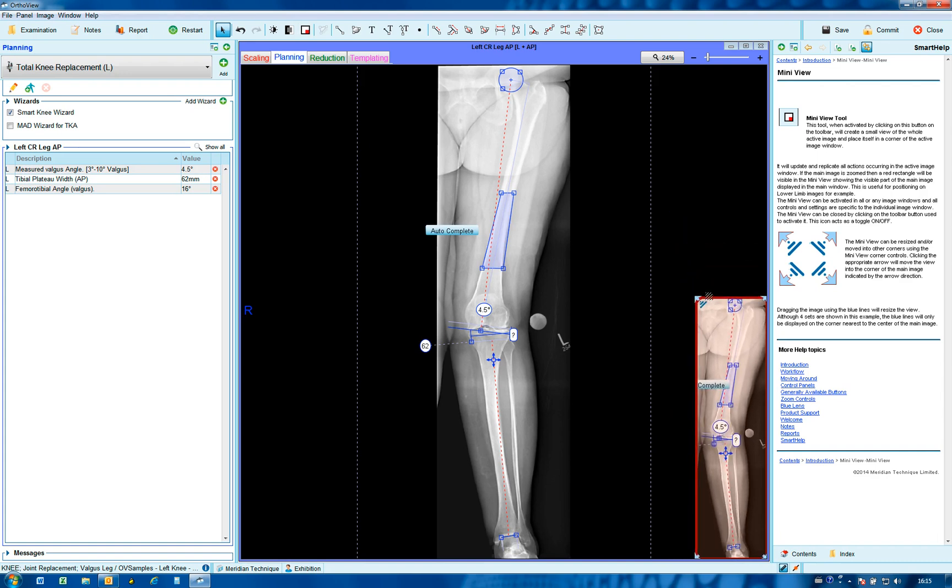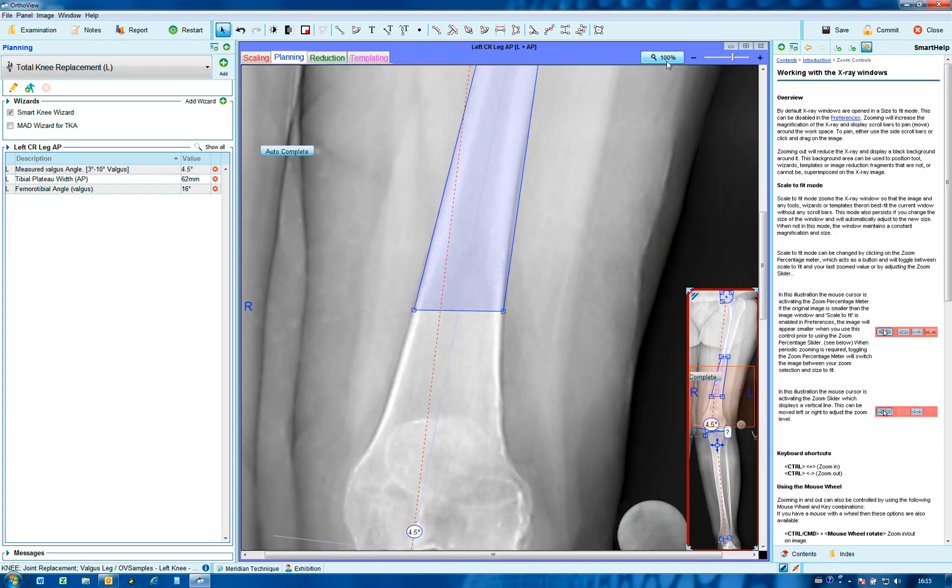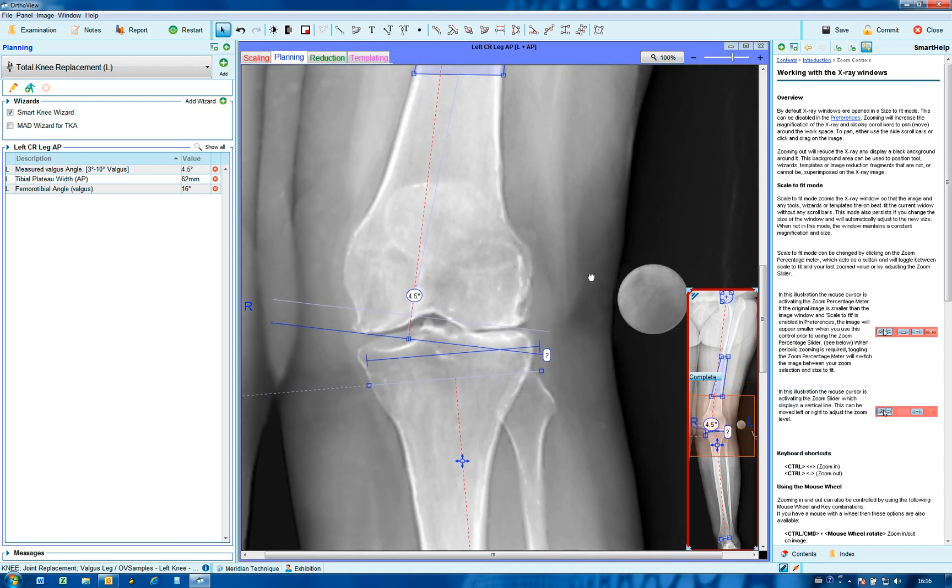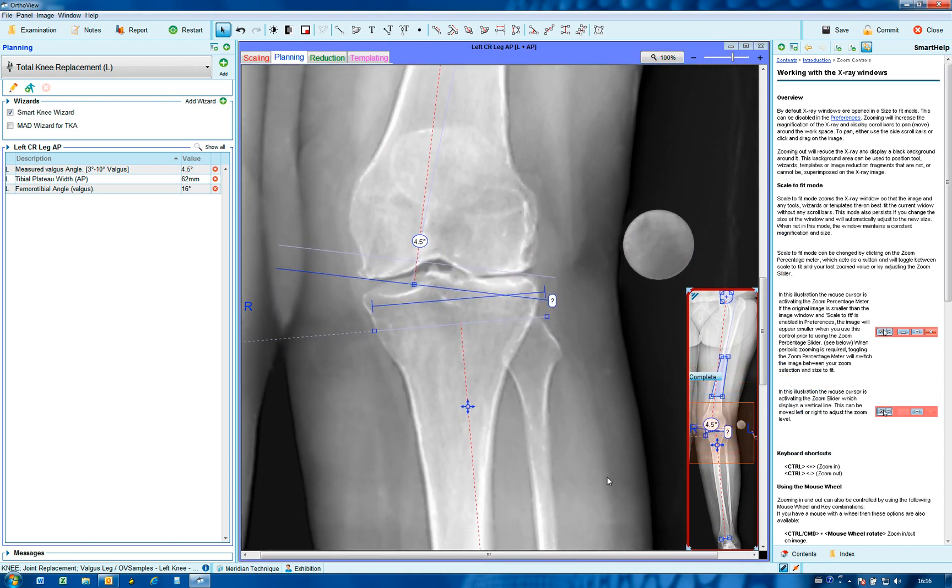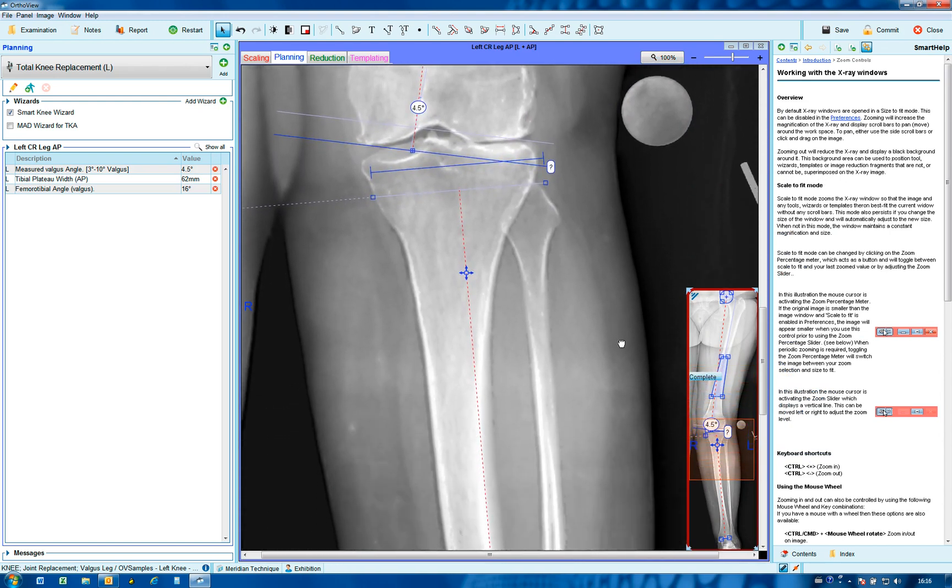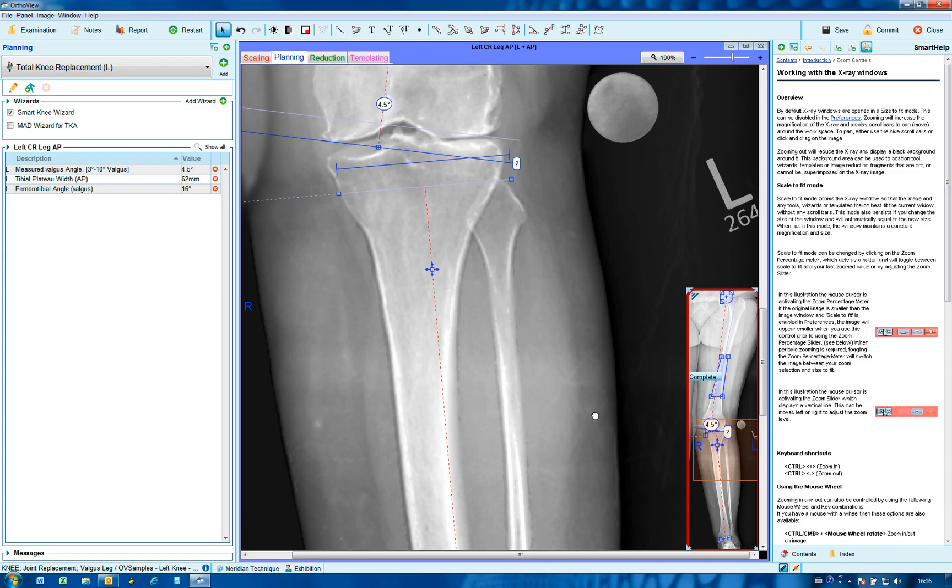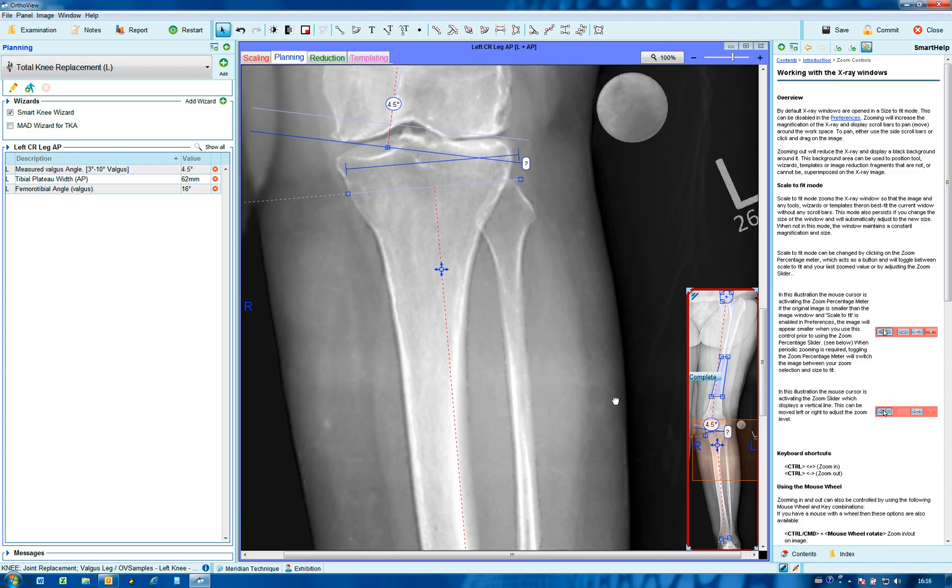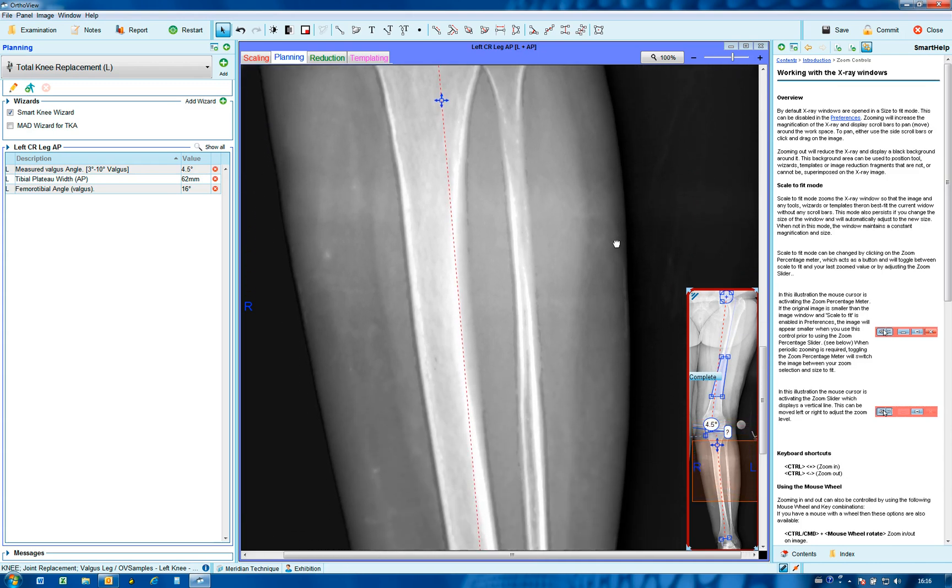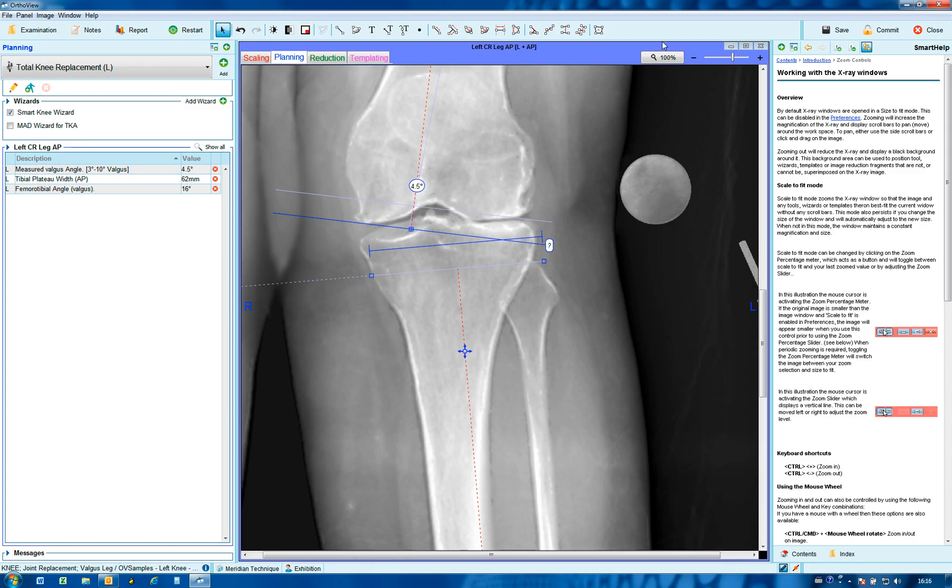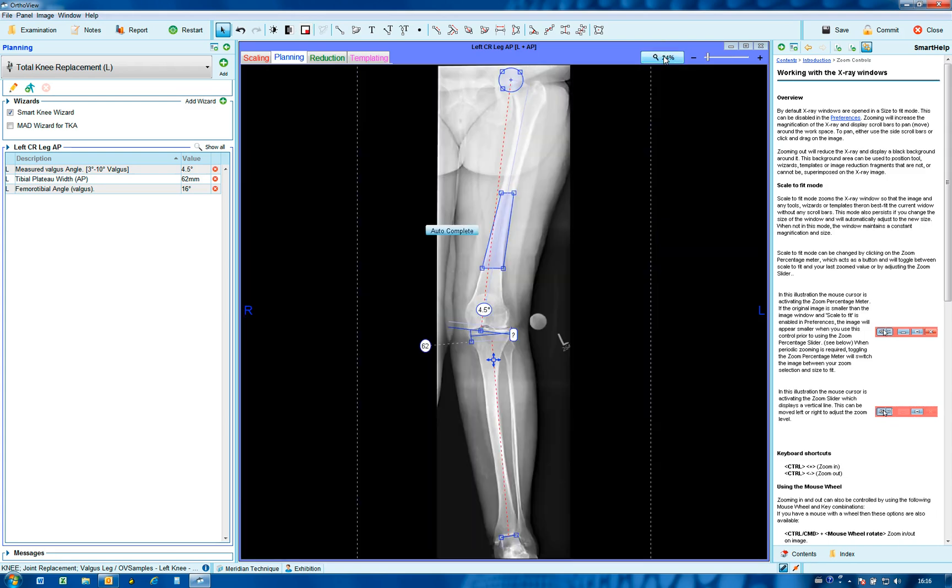When in a zoom mode anywhere on the image, it shows you where you are as you pan around the screen. It can be used on any image, however it is most beneficial on any long body image or a whole leg image such as this. Remove mini view, remove magnification.